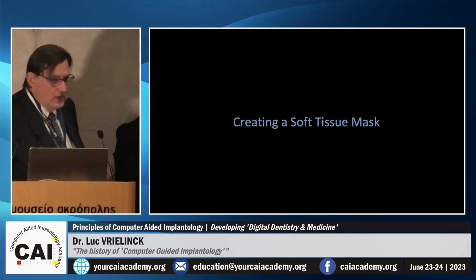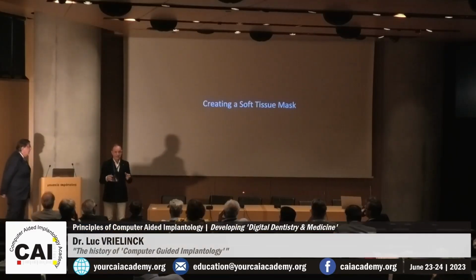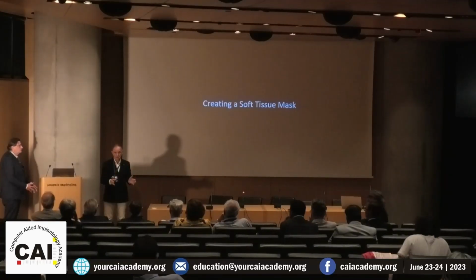But then we had a challenge with Philippe. How can we do that in a transmucosal way? And how did you do that, Philippe? Okay, the issue is that we could work only with guide laying on the bone. We could not do anything else. We were not talking about partial cases. We were not talking about full cases on the mucosa.